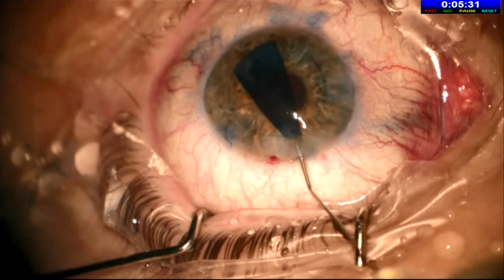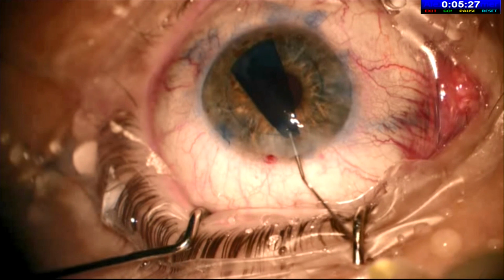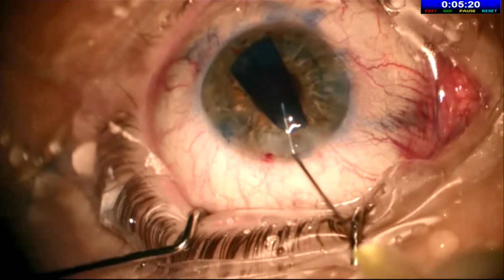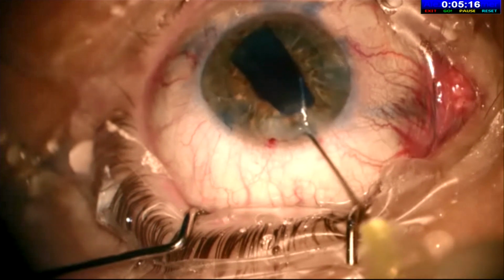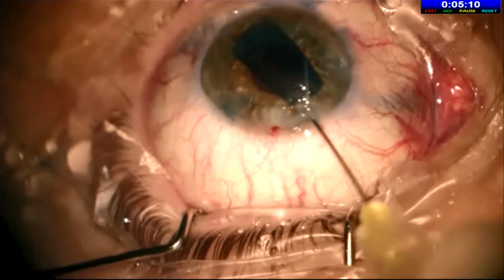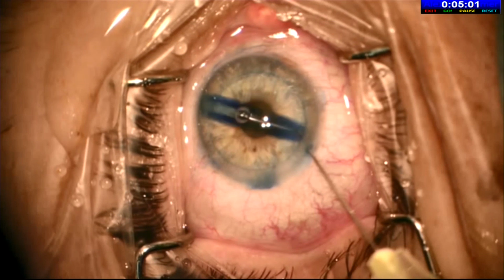Here I want to show you in slow motion a false Moutsouris sign, whereby this graft is actually upside down. However, we are under the graft and we are manually opening it, but we've opened it upside down. Now the trick is, when you enter the inside of the scroll, before you're underneath the flap, the silvery cannula should remain silver. So that's how not to be fooled.